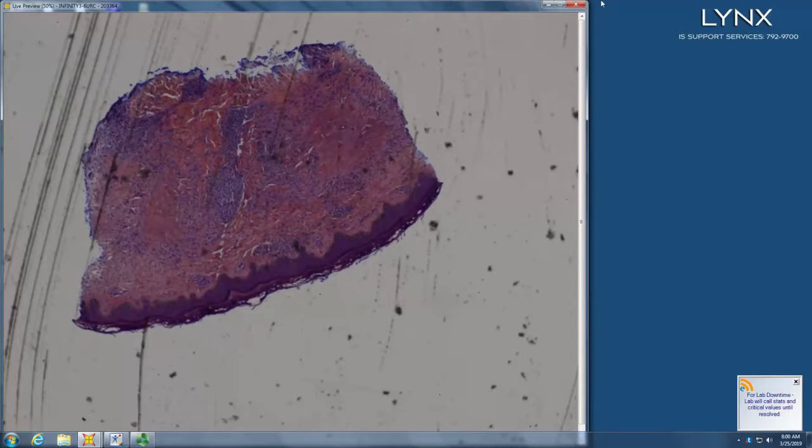I mean, I guess it could be NXG if it is necrobiosis. It could be GA. So GA with fibrin would be more deep GA, which is what this is, or rheumatoid nodule, although multiple little ones like that, patchy, is more like a GA pattern. So deep GA. And we call it deep GA even when it isn't deep, right?